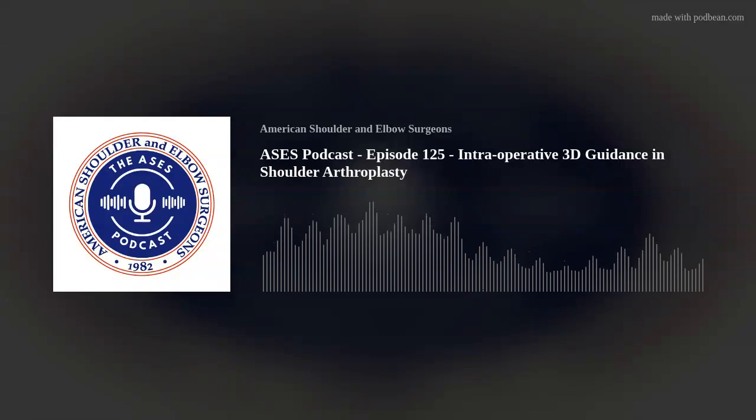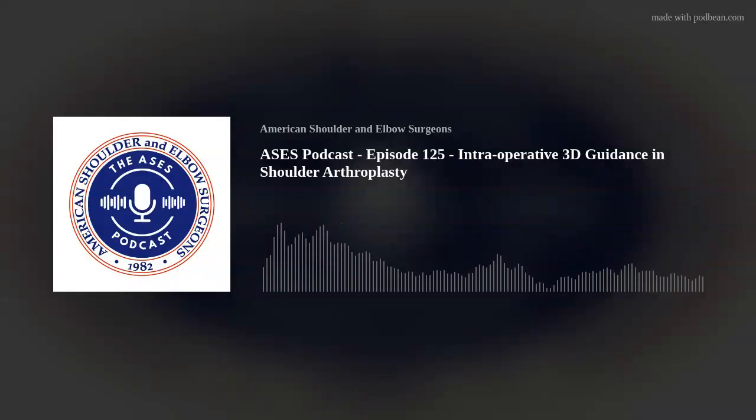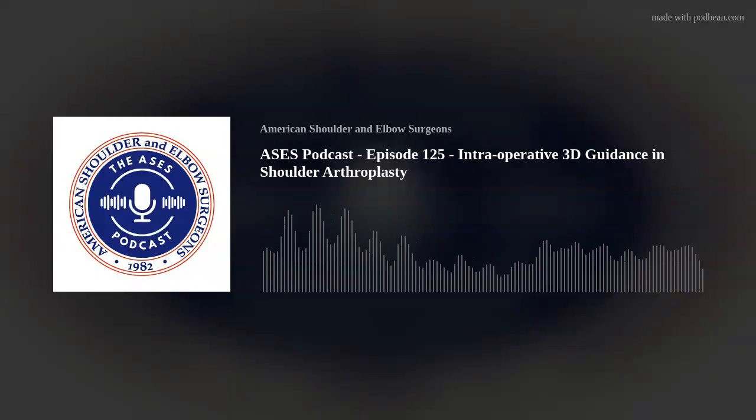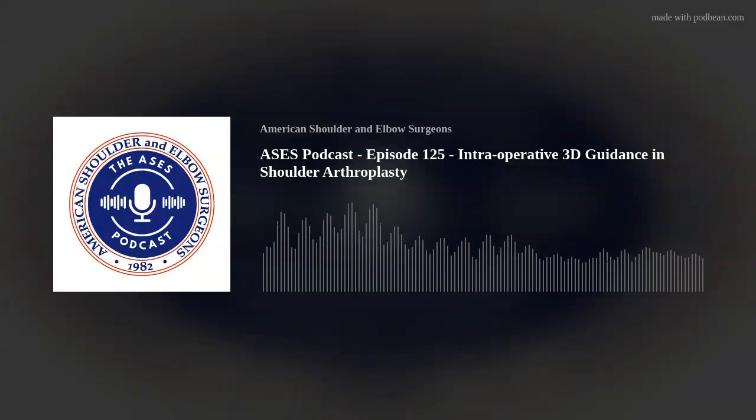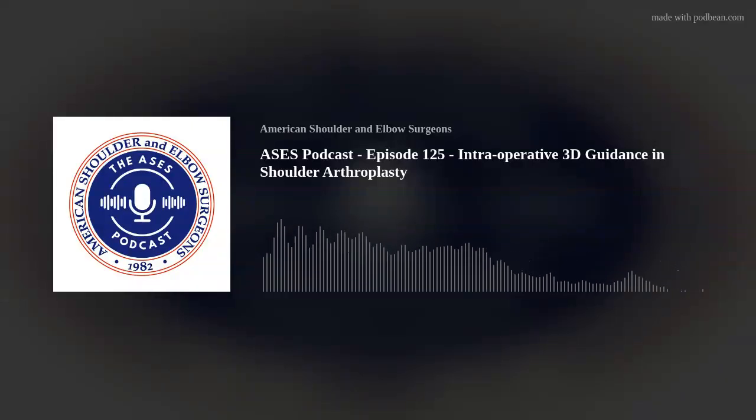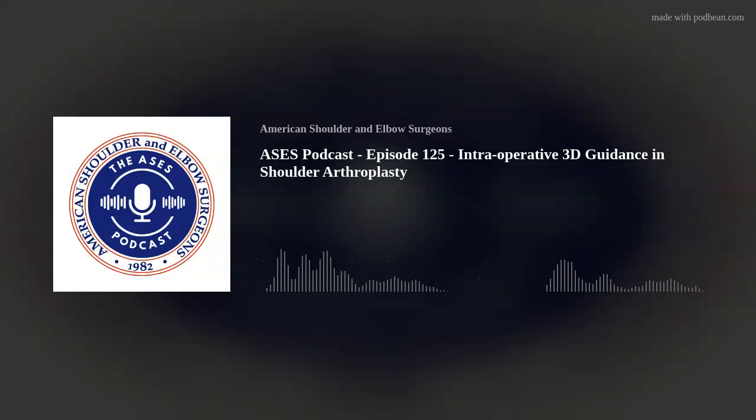I mean, why the robot? I think it's pretty clear, as has been mentioned, that a machine can prepare the bone more accurately than we can. And that comes down to the ability not only to place a pin, but to control how much reaming you're doing depth-wise. So there's more three-dimensional information to all of this than just version and inclination. We've boiled down a lot of our conversations on the glenoid to version and inclination, and a lot of people don't talk at all about the humerus. So the benefit of the robot is it allows us to really look at all of those aspects in three-dimensional space and understand the implant relationships through our planning software.